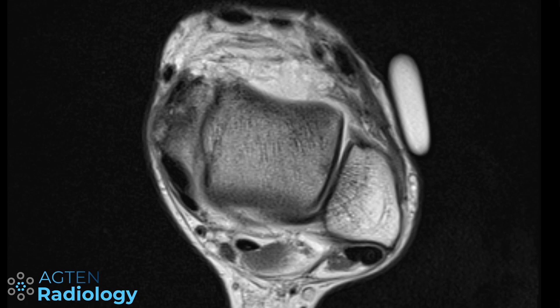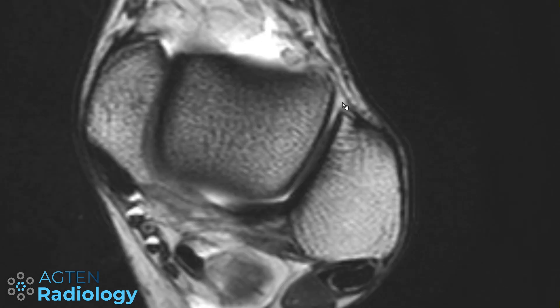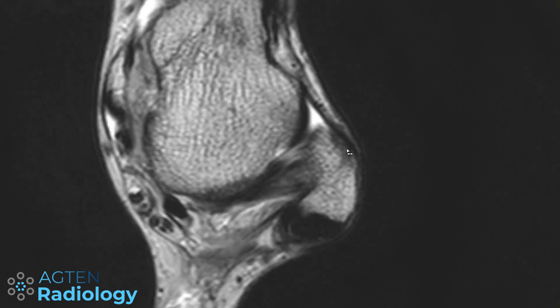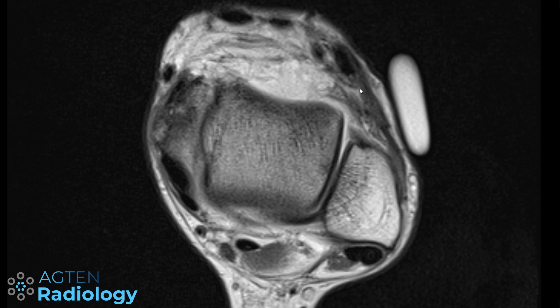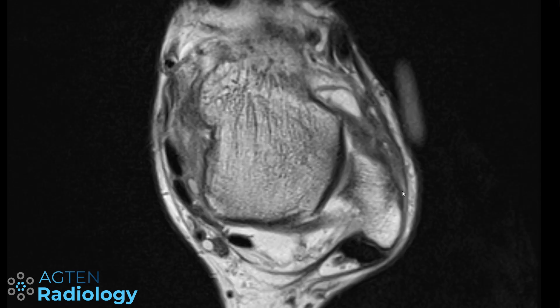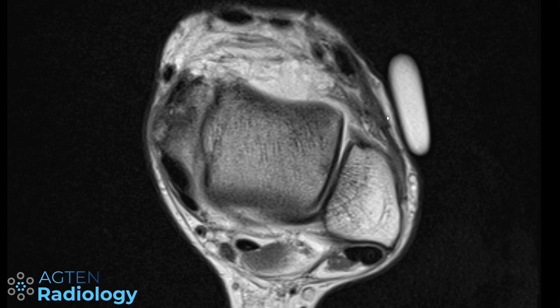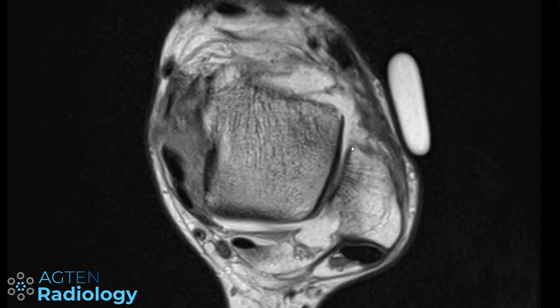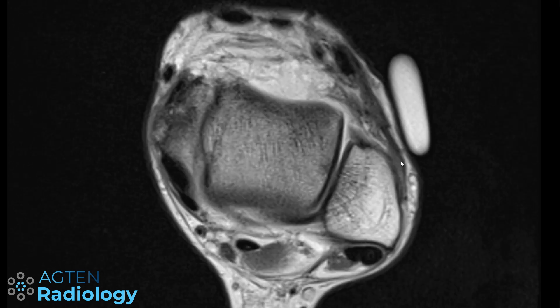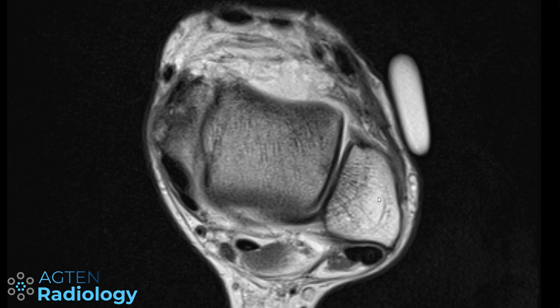Comparing this to the normal case: in the normal scan, the fascia runs straight onto the bone and the ATFL shows no stripping. In this patient, the fascia appears stripped — a possible mimicker of or contributor to anterolateral ankle pain, with the hypertrophic scar plate still consistent with anterolateral impingement given the patient's symptoms. I haven't found a paper specifically on this finding, so if you have any relevant literature I'd be happy to hear about it.